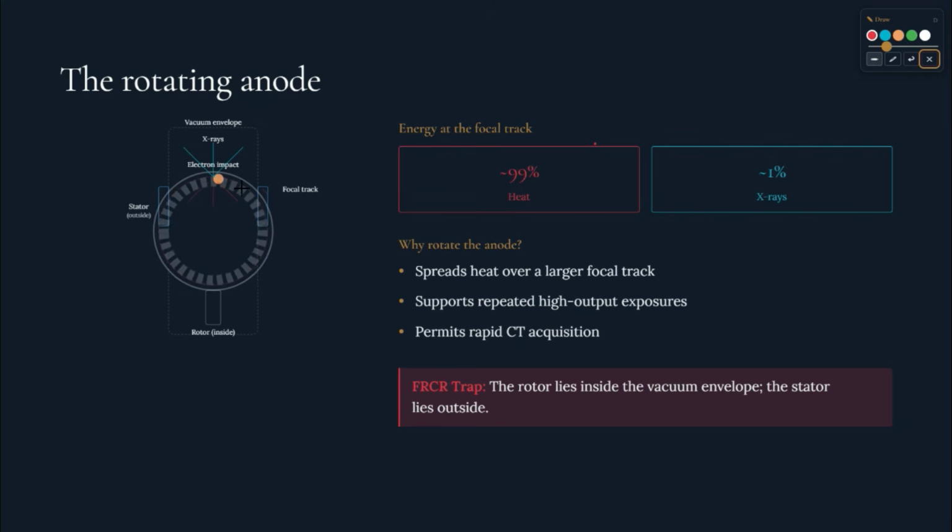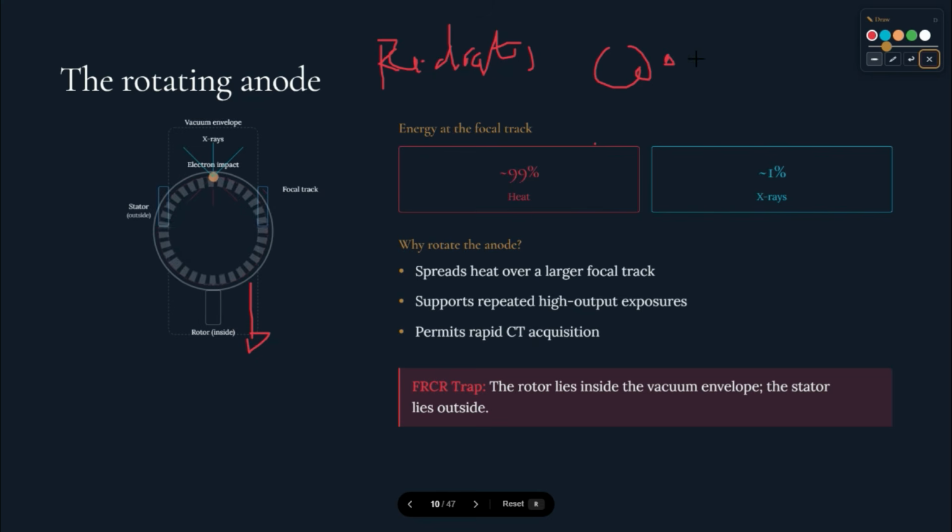Three methods are most important. Mostly radiation is the dominant method. Then we have conduction along the stem, out from the stem to the outside. We also have convection through the oil of the case.